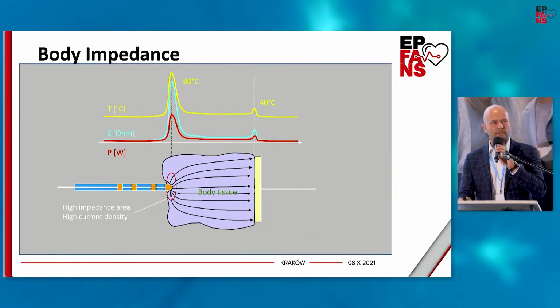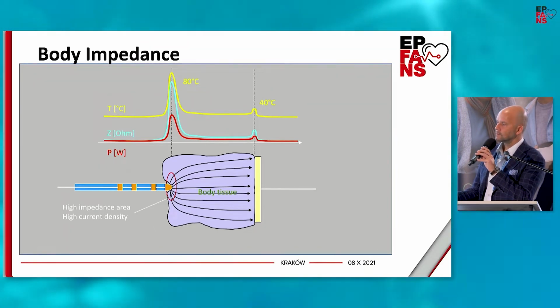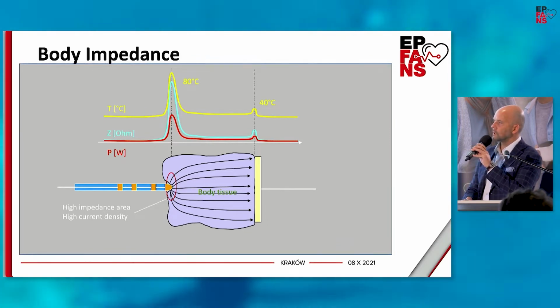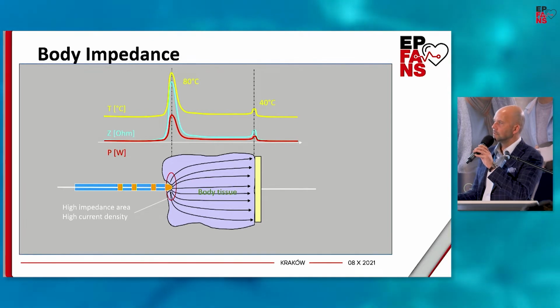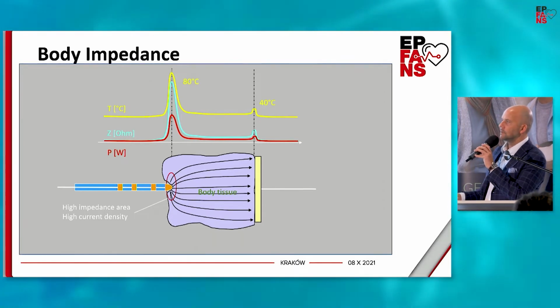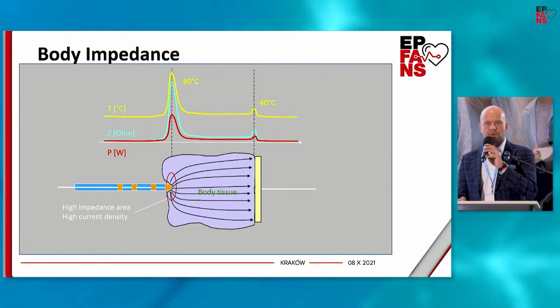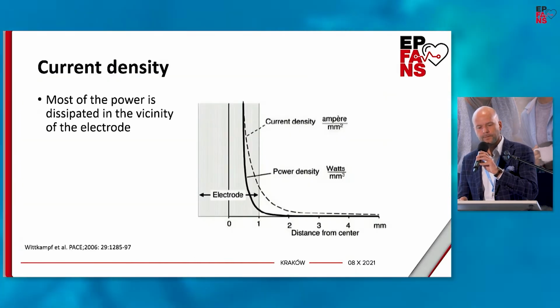But if you use silicon multi-use dispersive electrode, be sure that there is a perfect contact with patient's body, just to avoid second high current density region on the skin. There are case reports showing skin burns in case of bad dispersive electrode to skin contact, as there are two regions of ablation, the second one on the patient's back.